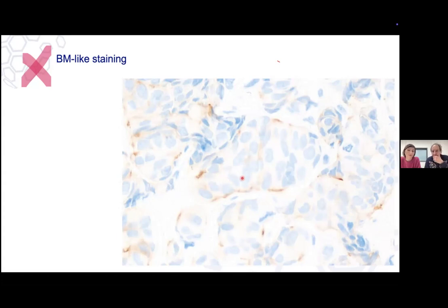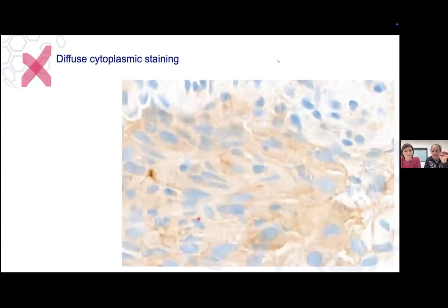And again, you don't have staining in between the cells. Every now and again, you may see a line here, but this stronger staining definitely not. Now, this is another pattern that is cytoplasmic, clearly cytoplasmic. And some of us are tempted to say, but look, I think I see lines here. Remember that checkerboard? Think twice before saying, I think there is staining here, because this can be created just by the interface of two cells.